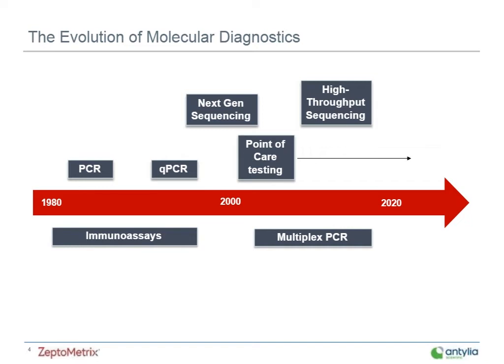Syndromic panels, those that look at bloodborne pathogens, GI, respiratory, tuberculosis, just to name a few. Not only can we now test for these diseases themselves, but we can now directly identify important antibiotic resistance markers. The impact of this, you could go on and on talking about. So obviously this is not an incredibly in-depth look into the field at large, but I think the point I want to impress is that the advancement of molecular diagnostics has been relatively fast, scientifically speaking.